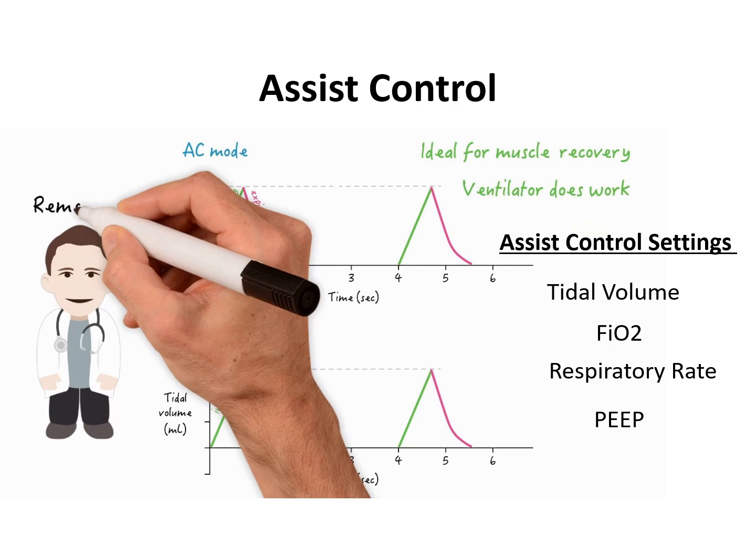Usually this is the patient that is resting, they recover from some insult such as a rib fracture or they had surgery, but this usually has fairly good lung compliance. These patients usually don't have restrictive lung compliance and are able to be ventilated, and those are the patients that work best on assist control.